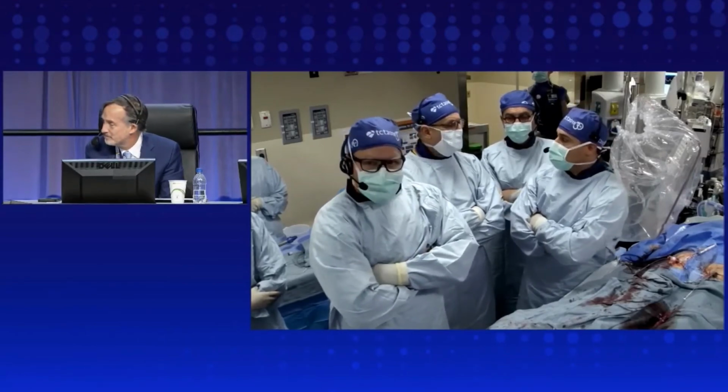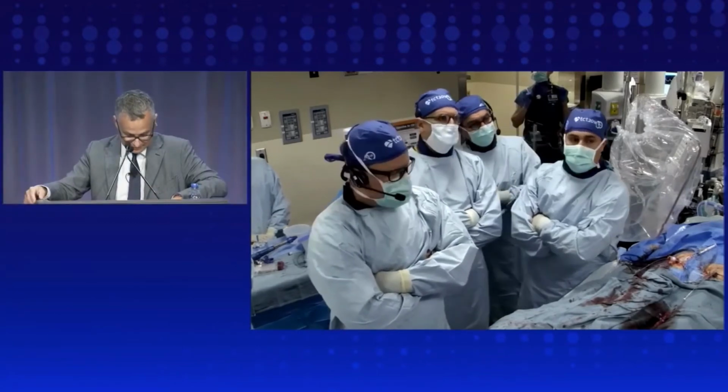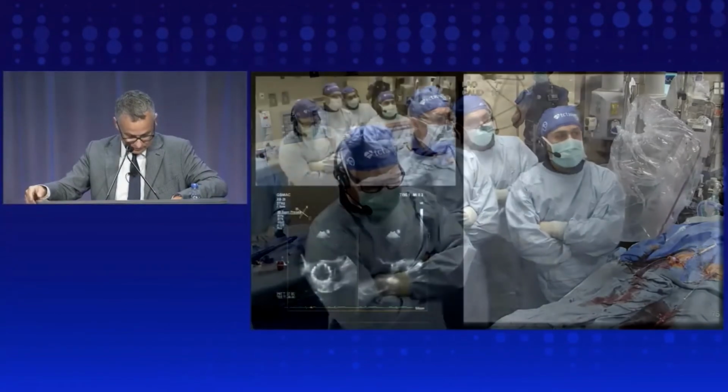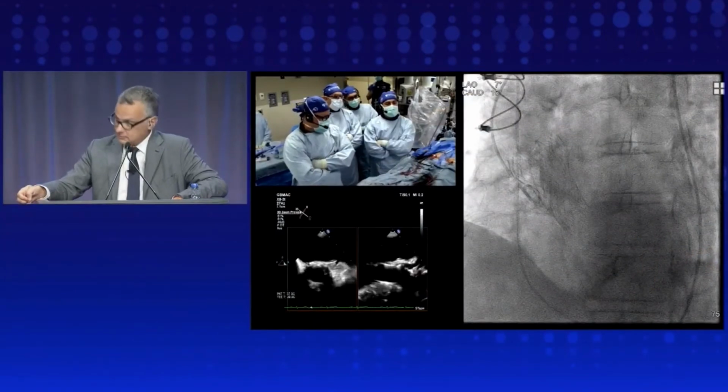Right, and I think that's the only other... I'm sorry, go ahead. This is Charlie. Yeah, it looks like the spasm. We're going to just wait a little bit. The pressure's good. The ostium looks good. The post-procedure injection looks good.